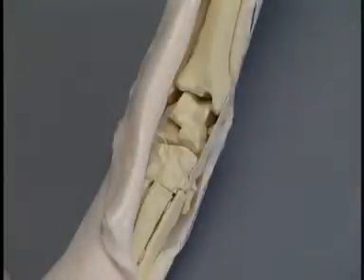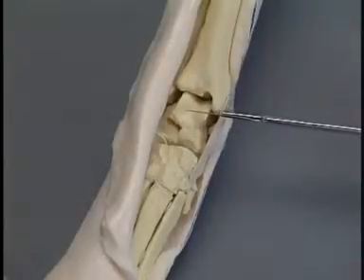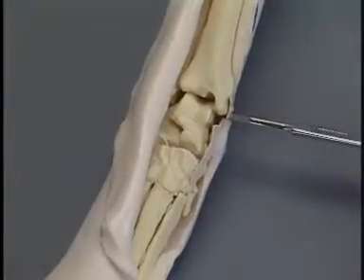The foam is incised on the medial aspect of the tarsal joint. The foam is retracted to expose the cranial surfaces of the distal one-third of the tibia, the tarsal joint, and the proximal half of the third metatarsal bone. The medial collateral ligament is cut to gain access to the joint surfaces.